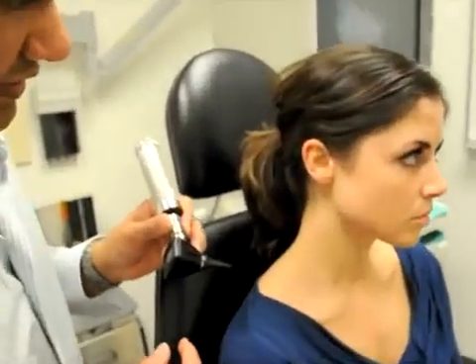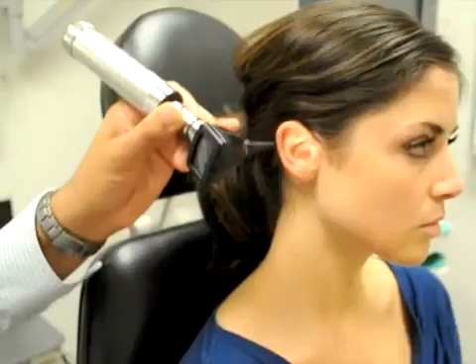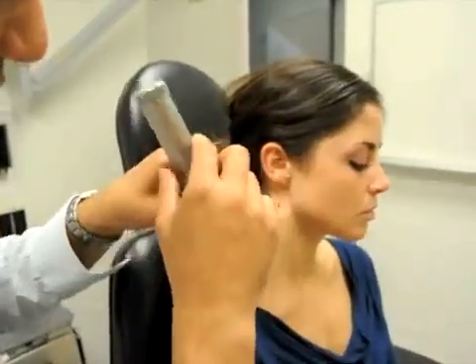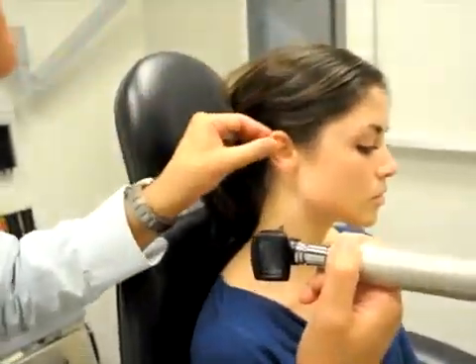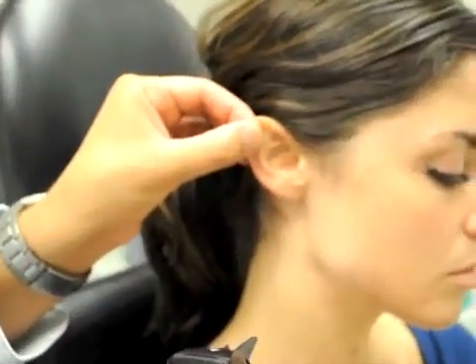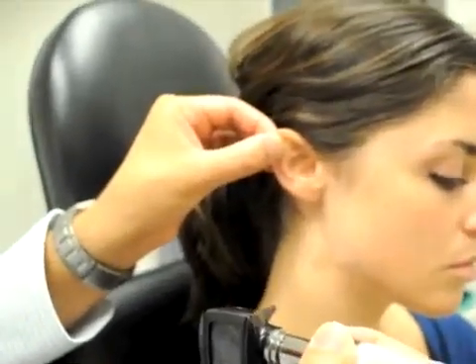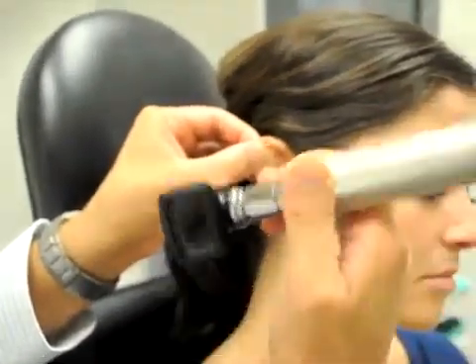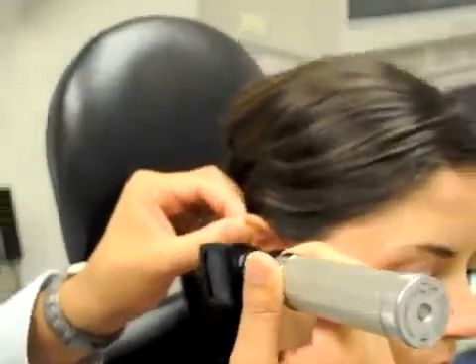So I've now moved to Brittany's contralateral right ear and I'm going to examine it. As you will see, I need to switch the scope from my left hand to my right hand in order that I don't cross hands. I now use my left hand to pull on Brittany's pinna to straighten the external auditory canal out. This is also an important clinical finding in otitis externa. If Brittany had inflammation of her external auditory canal, this would cause her significant pain. Again, I rest my little finger on Brittany's cheek here and then insert the otoscope.